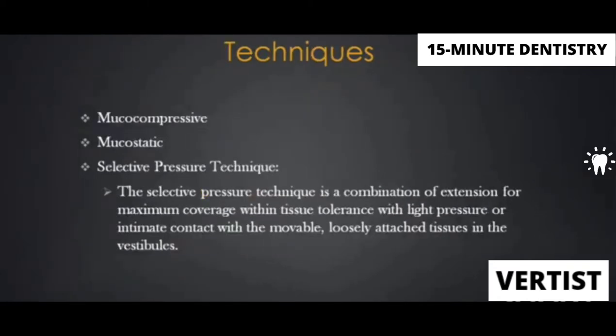So which are the impression techniques? There are a lot of classifications: open mouth, closed mouth, primary, secondary, using stock tray, using custom tray, all that. Most commonly used are mucocompressive, mucostatic, and selective pressure. Mucocompressive and mucostatic are very self-explanatory.